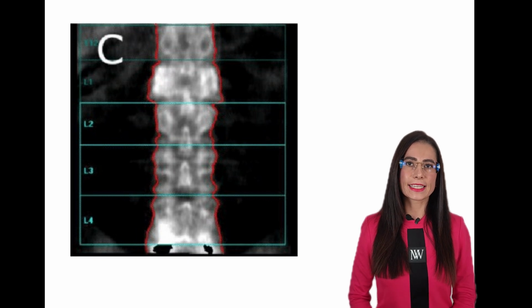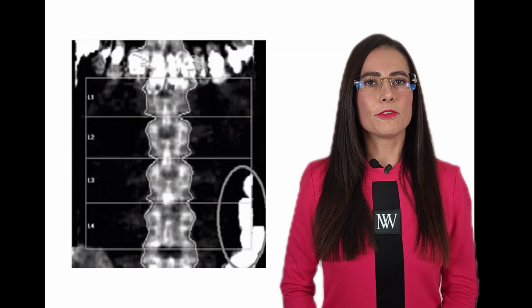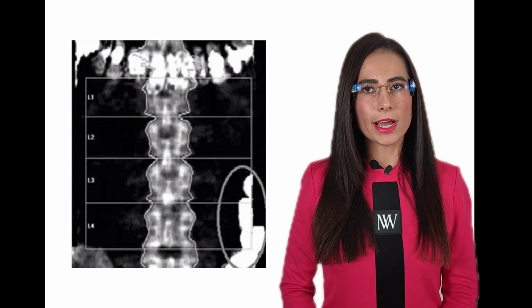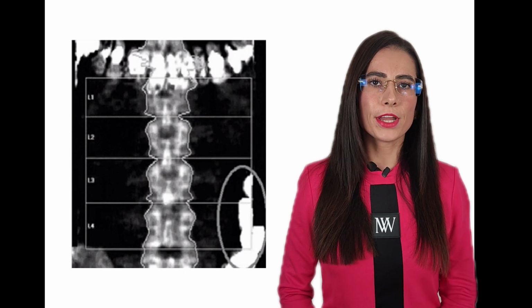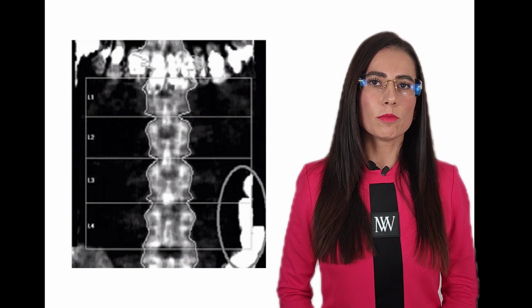Rare bone disorders such as Paget's disease can result in increased new bone formation as a result of prior excessive bone resorption. The bones become very large and show an unrealistically high bone density on the DXA scan, when in fact they are weak and fragile. If you had an imaging study with contrast media, be aware that it could also lead to increased bone density.